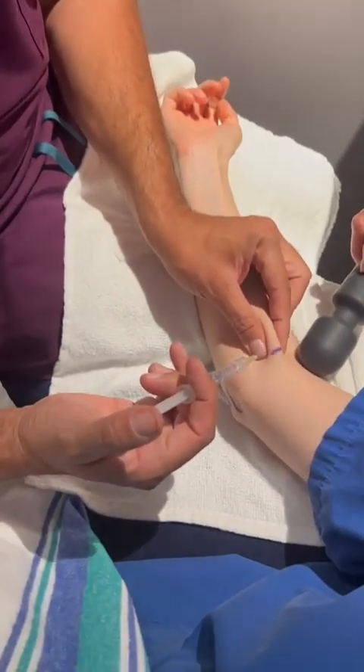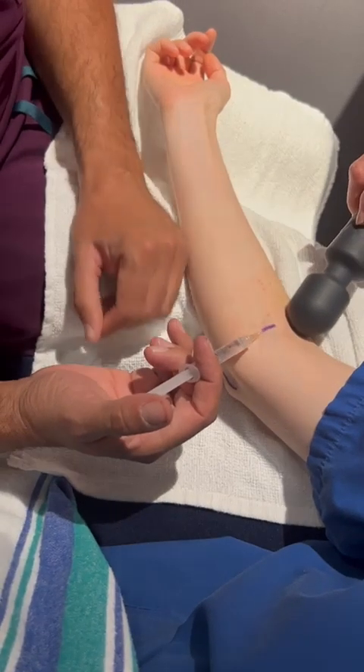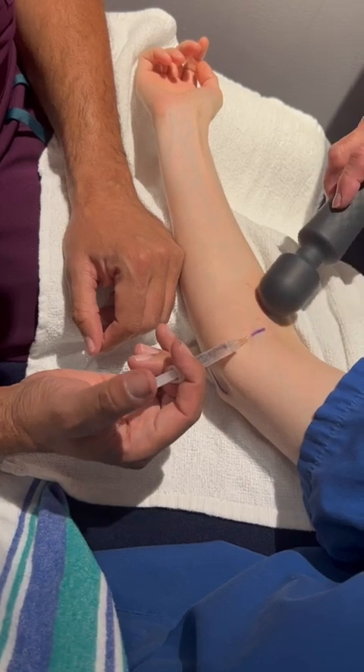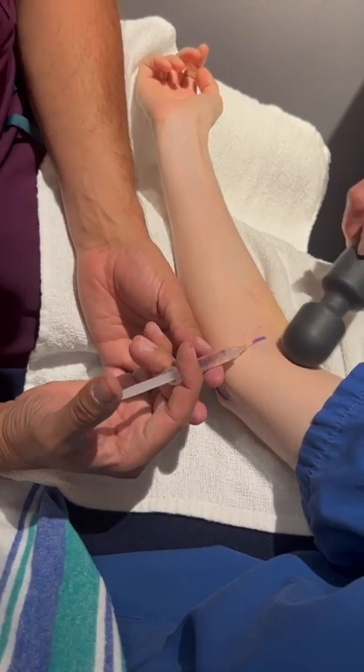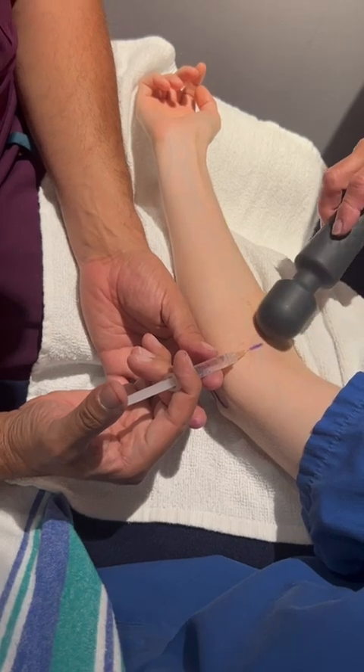One, two, three, and poke. How is that? What's the score? Like a one. It's a one.